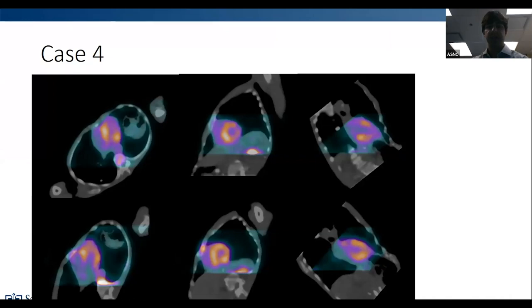Positive, I'm assuming. People are saying on the chat. Here's another set of images. What if I told you that this one was at 10 minutes, and then this one was at 1 hour? So this is obviously not in the guidelines, and we're just studying this now.